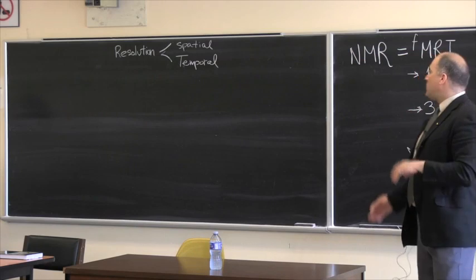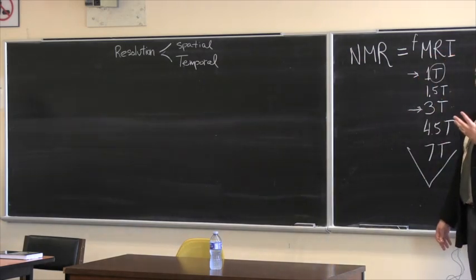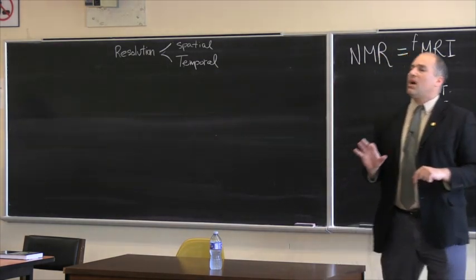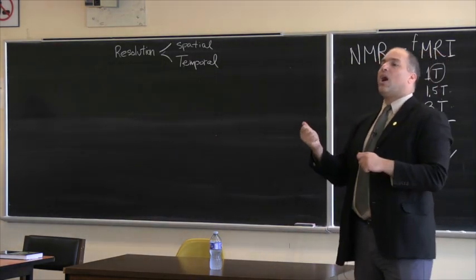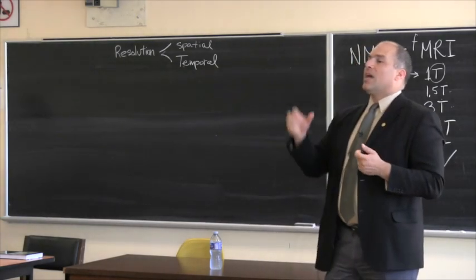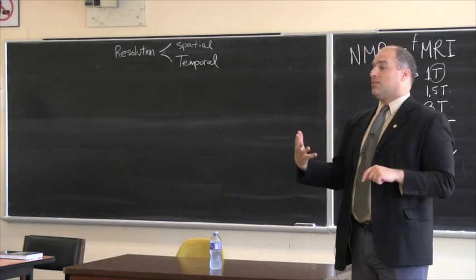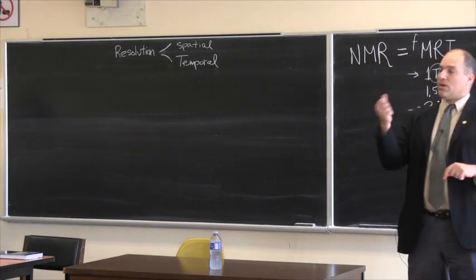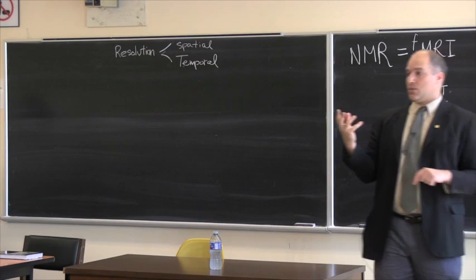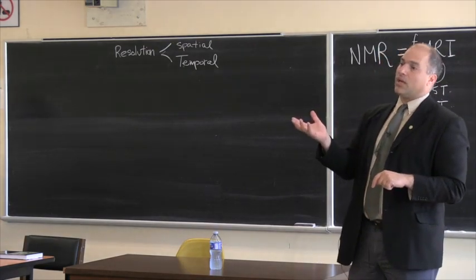And the idea is that you can take an MRI, usually a high resolution MRI, which would show you the picture of the brain, and on top of that you can impose some kind of a metabolic change that would show you how much blood has been oxygenated or not oxygenated as a result of allegedly neuronal activity, because when neurons are working, they're allegedly using up oxygenated blood, a little bit like a muscle analogy, which is not perfect but not entirely out of this world.